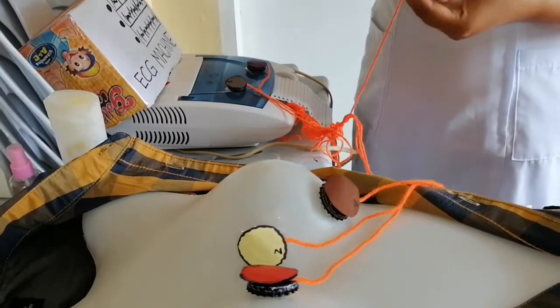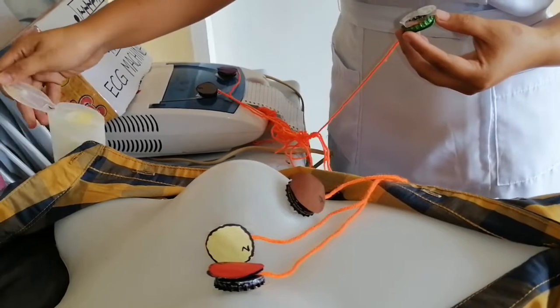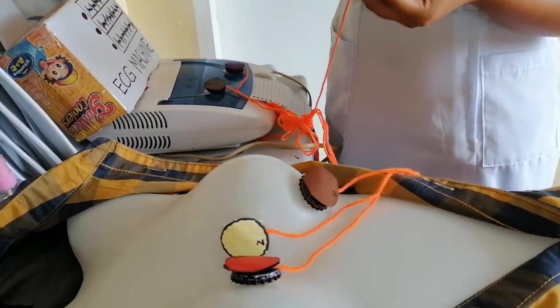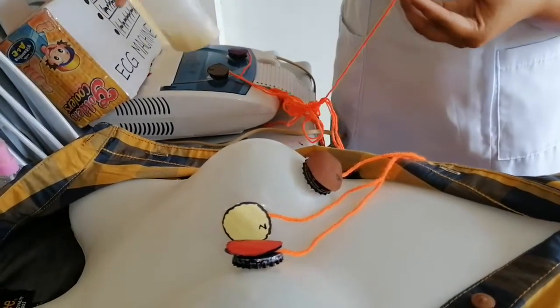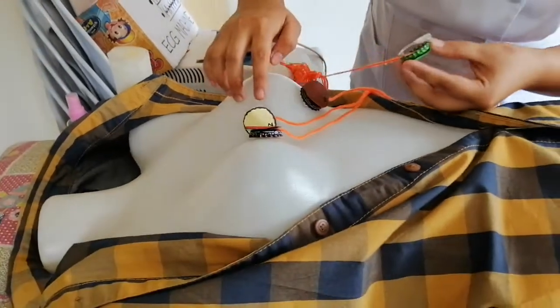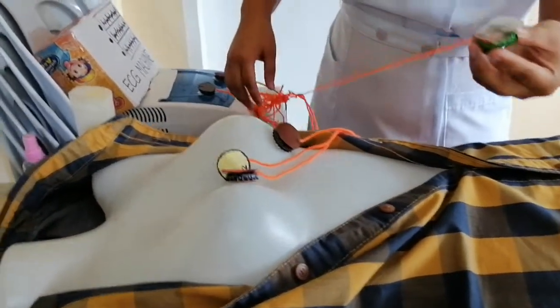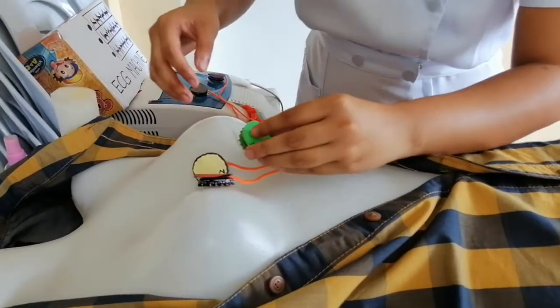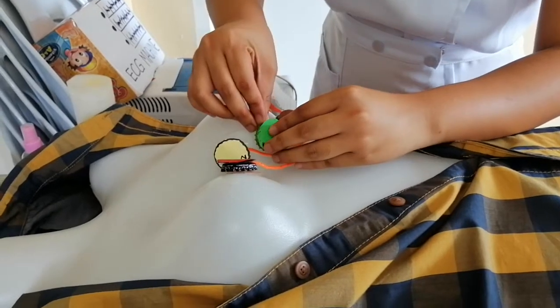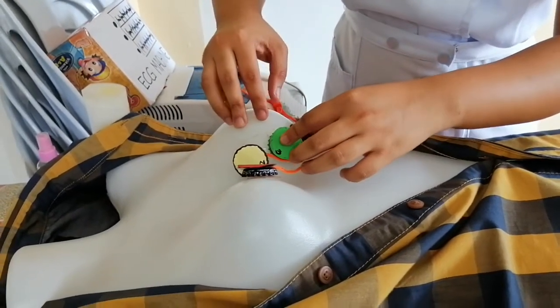So, it is now very easy to recognize the location of the V3. But first, we need to place an electrogel. So, between V2 and V4, you are now going to place the V3 diagonally. V3 will also help to determine the anterior part of the heart.